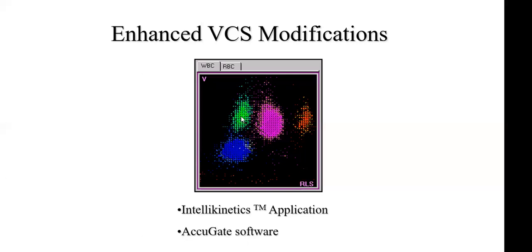So what population can it be? Any guess which population is this green color? Anybody can try for this? Monocyte. Yes, very good, Charu. This is monocyte. So why is monocyte showing low scatter here? Because it's an agranular cell. The granules are usually absent from the monocyte.